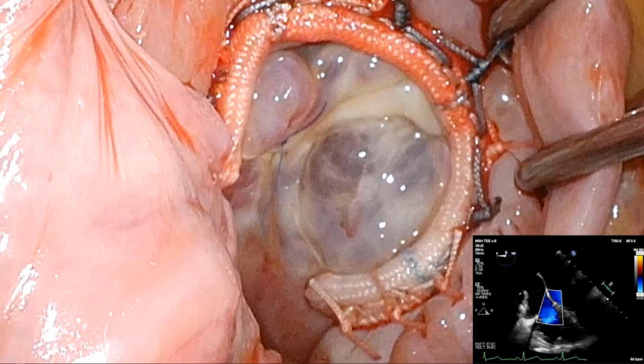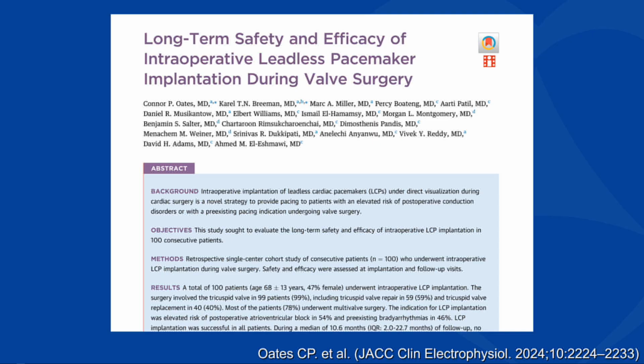There is a lot of progress in the technology for leadless pacemakers to avoid pacemaker-related complications. As we know, the patient can have endocarditis, risk of thrombosis, valve dysfunction and cardiomyopathy, etc. We have published almost the biggest series in the world on leadless pacemakers, and we proved that it's actually safe and efficient, and it has its financial incentive.